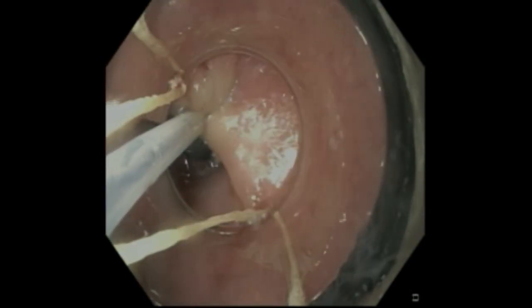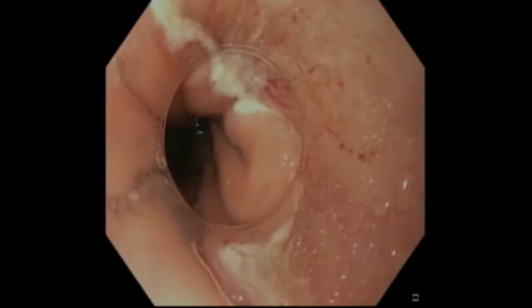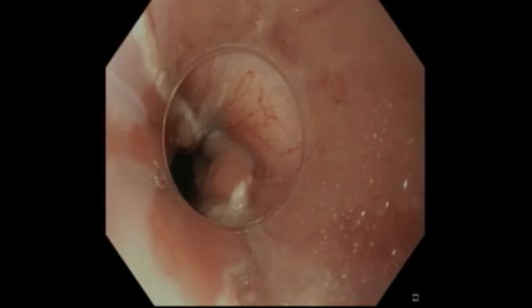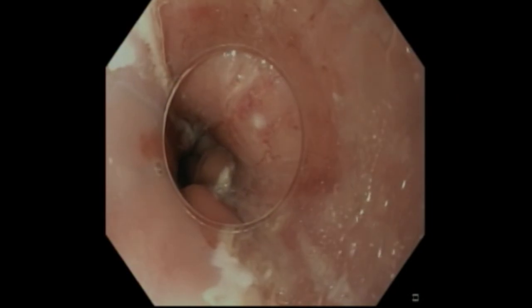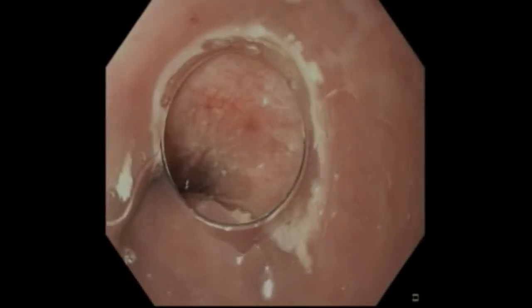It's important that we carefully inspect the margins to ensure complete removal. Here the entire area of the right-hand side of the screen has been safely and effectively removed.